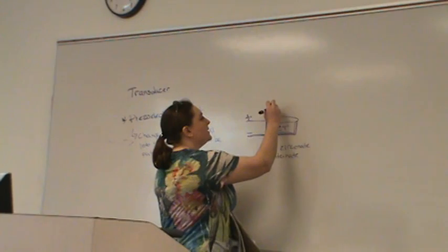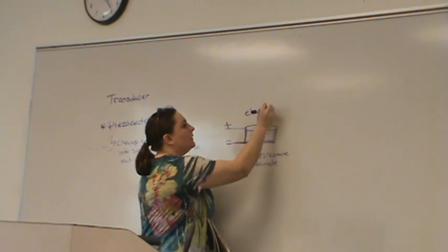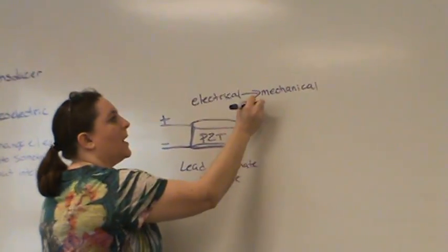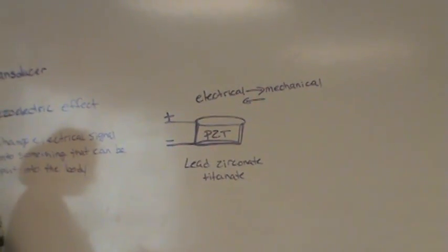And the whole point of PZT is to take that electrical signal and convert it into the mechanical signal. And then on the way back, it goes the other way. It'll convert that mechanical signal back to electrical signal.